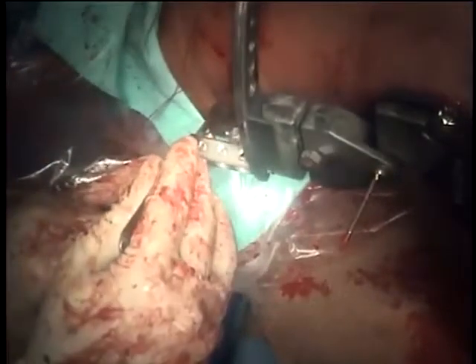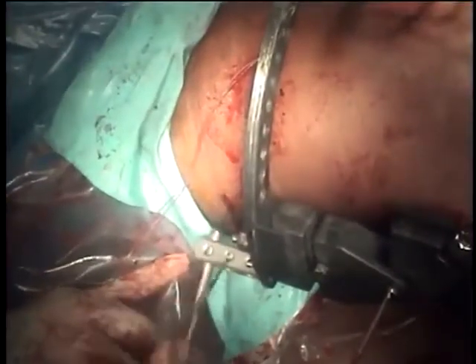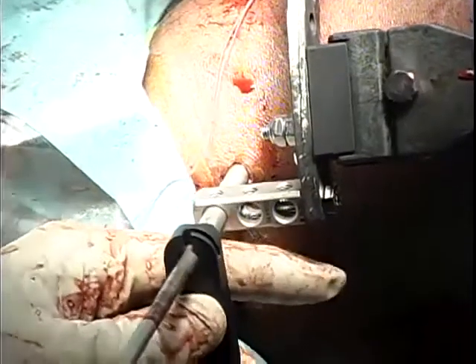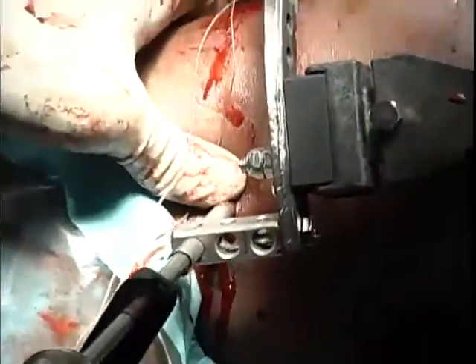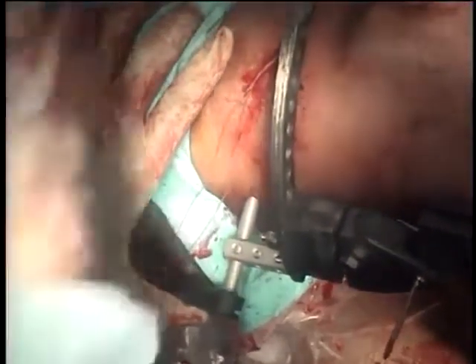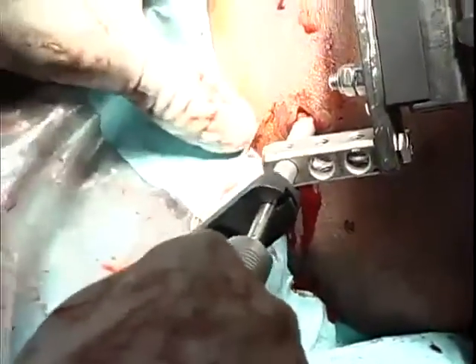Repeat the procedure with the three-hole Rancho cube on the lateral side. Make a generous stab incision through skin only, posterior to anterior, spread with Kelly, and place the triple trocar to bone. Remove the centering portion, insert the drill bit, feel the anterior and posterior femoral limits, center, drill to the far cortex, stop, measure, add 5 millimeters, and drill the far cortex. Place the second 6-millimeter femoral pin by hand using the quick chuck.